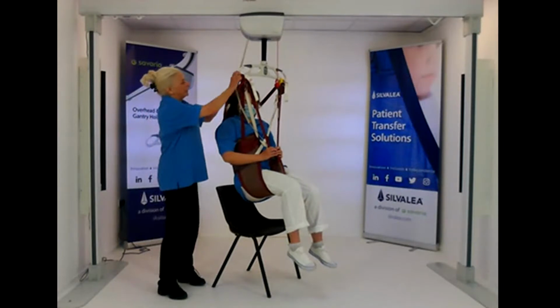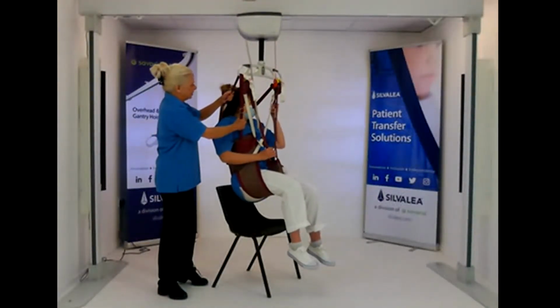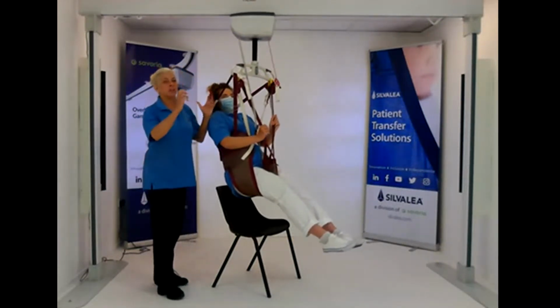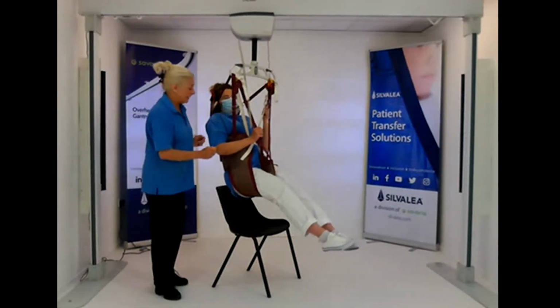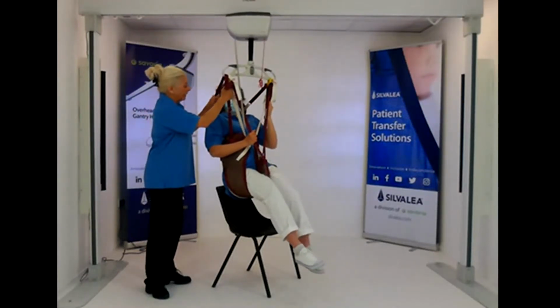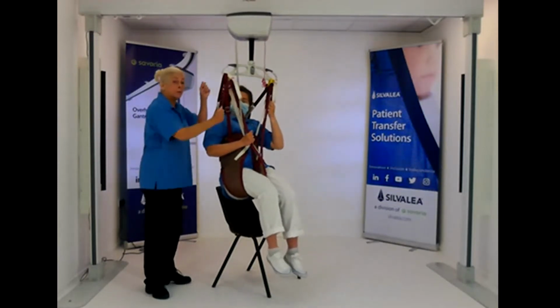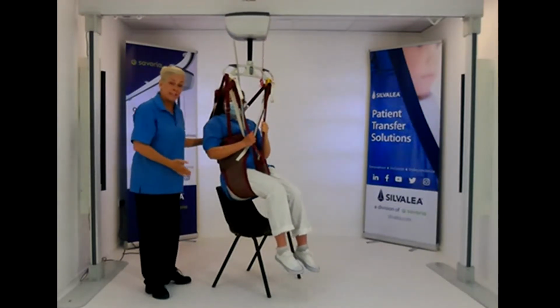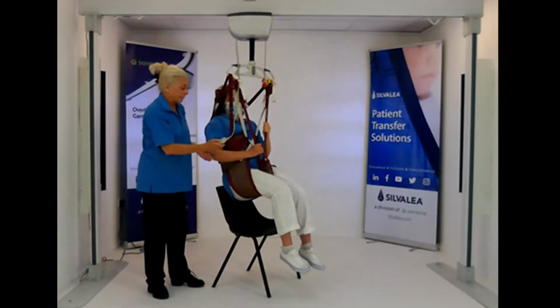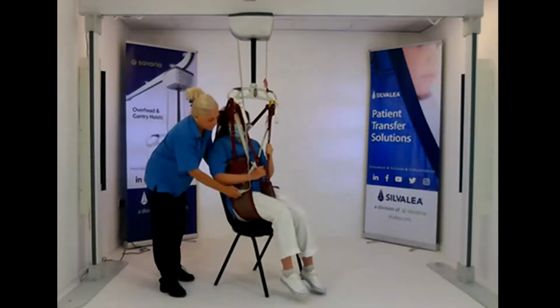The counterbalance straps on the side also, if Laura was slightly extended, can you extend back? If she's pushing back and you want to try and get her into a more seated position, you can, if there's two carers, of course, pull on the counterbalance to sit up. So either side will help to pull up. If you're trying to position into an upright chair, it's quite a good feature by having that counterbalance there.